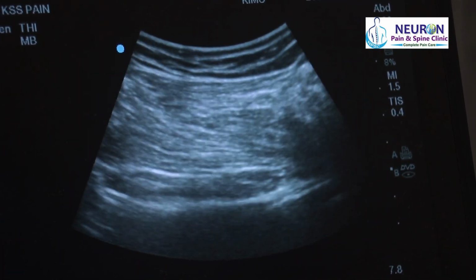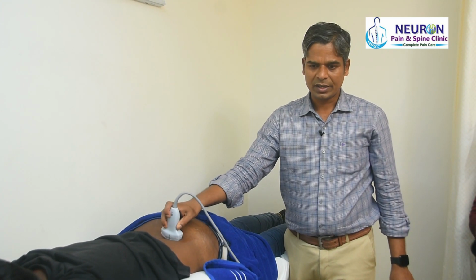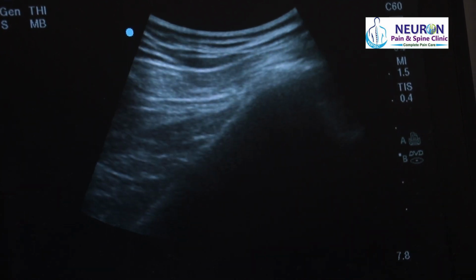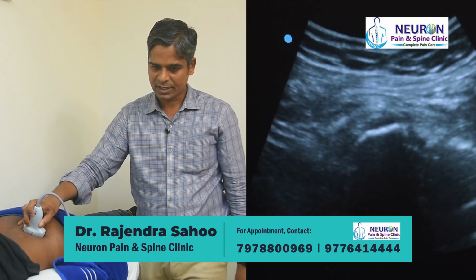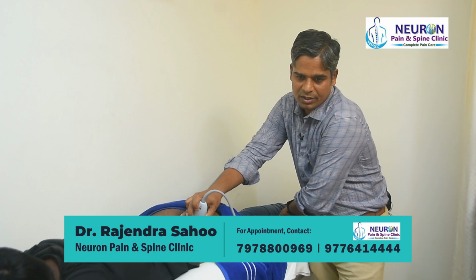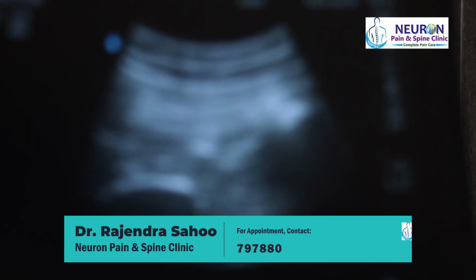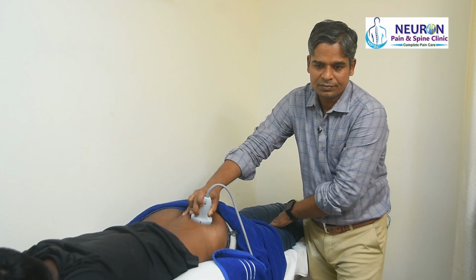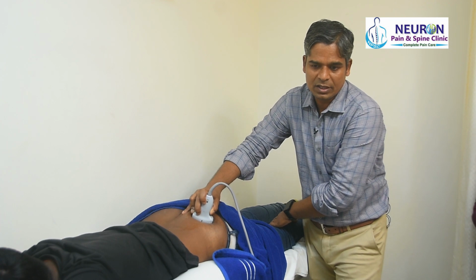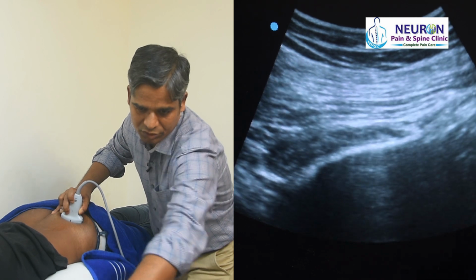That concludes a stepwise examination of your gluteal muscles, starting from the PSIS, seeing these muscles, reaching the greater sciatic notch, looking for piriformis, slowly going down to the ischial spine, the sacrospinous ligament, and the sacrotuberous ligament.